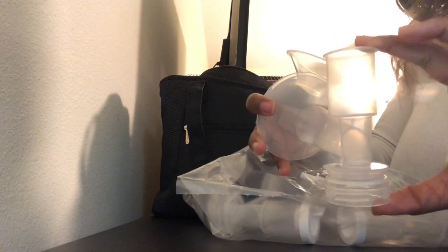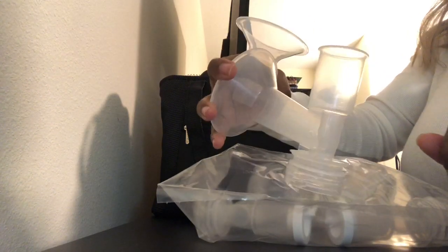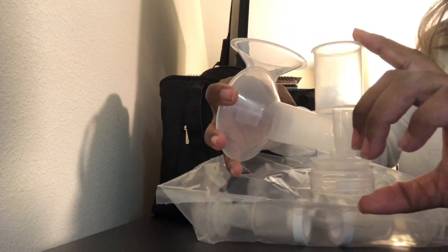So if you're sitting, you really gotta be sitting upright, maybe tilted a little bit, so it doesn't hit against your thighs. And then of course here's the tubing and stuff. Are the valves already in there? Yep. And an extra set of valves.